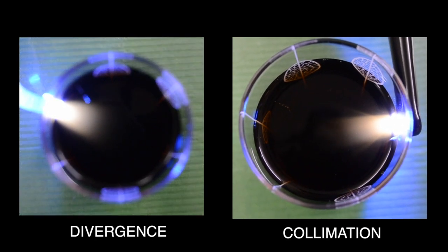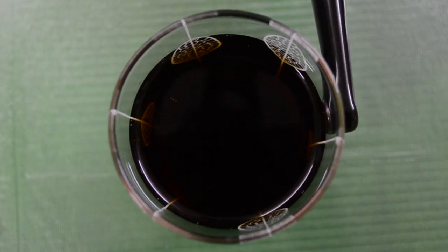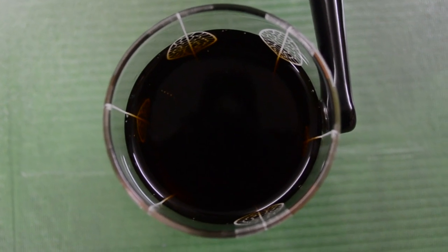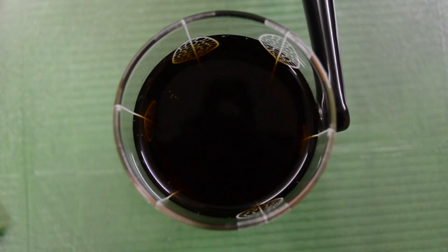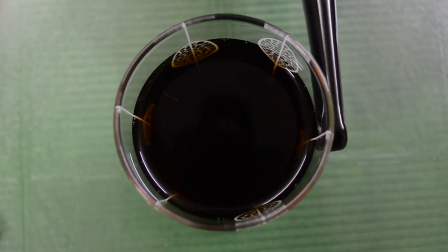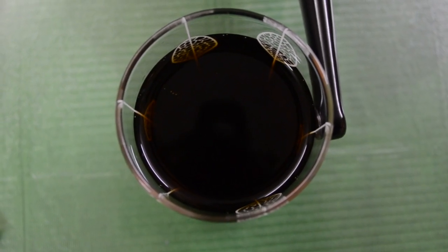The Ultradent Velo has three modes, and just for the heck of it let's see what happens to the light intensity with each mode. We've switched to a more powerful mode — it's a four-second cure mode. And I finally switched it to the third mode, which is supposed to give you an output of about 3,000 milliwatts per centimeter squared for about three seconds. Let's see how this fares.